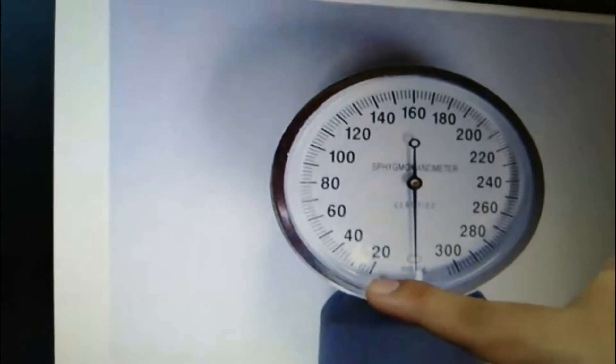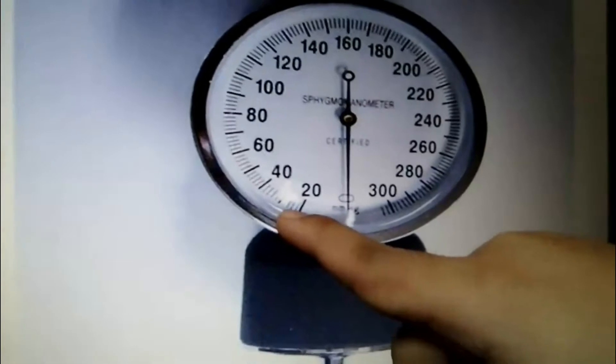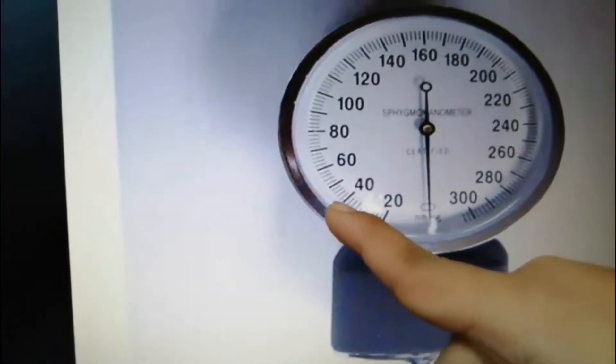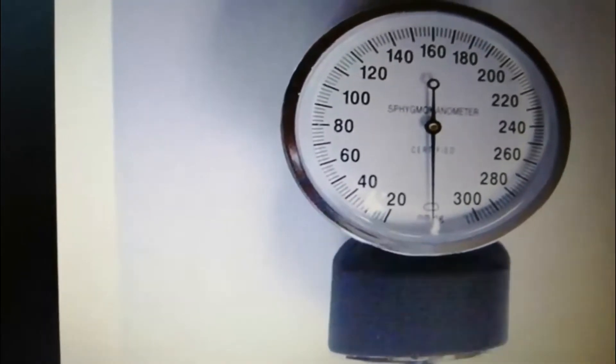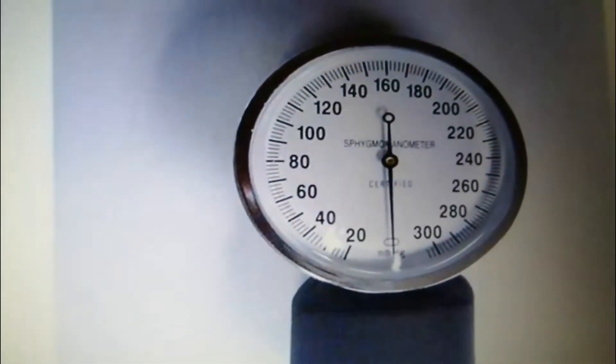In each part there are five lines, so the increments go by twos: 20, 22, 24, 26, 28, 30, 32, 34, 36, 38, 40. That is the proper way of reading the aneroid gauge.